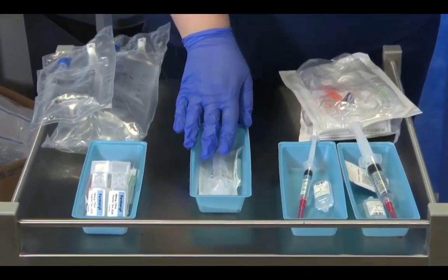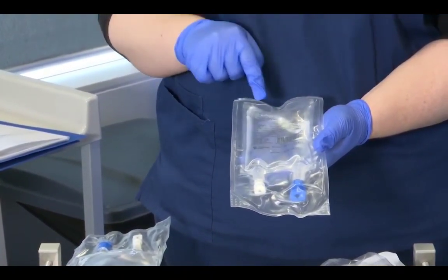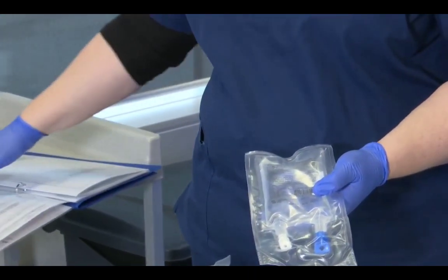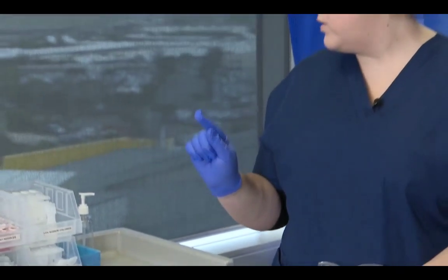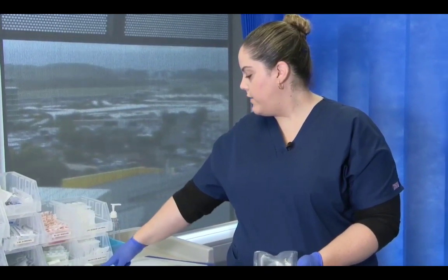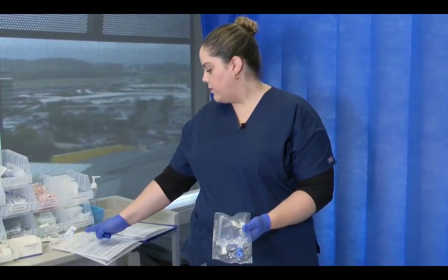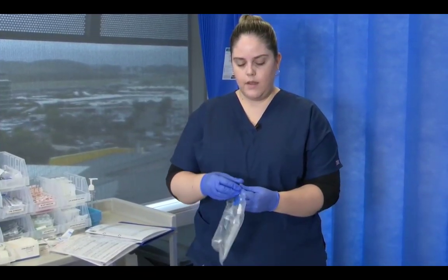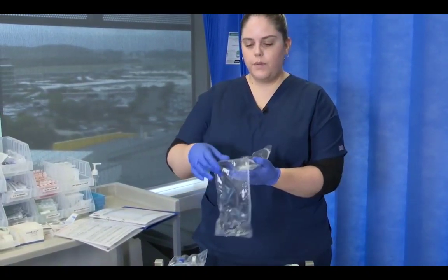Now we're ready to remove the fluid from our 100 ml sodium chloride bag. So again, sodium chloride 100 ml 2025, but this time I need to check this against the order which stated that I was reconstituting my fentanyl using sodium chloride 0.9% to a total volume of 100 mils. And that's for John Bryant, who has no allergies, and this is for the IV route with fentanyl, etc. So I'm doing all of my checks. So I've got my sodium chloride and I'm opening my bag. Just peels open.